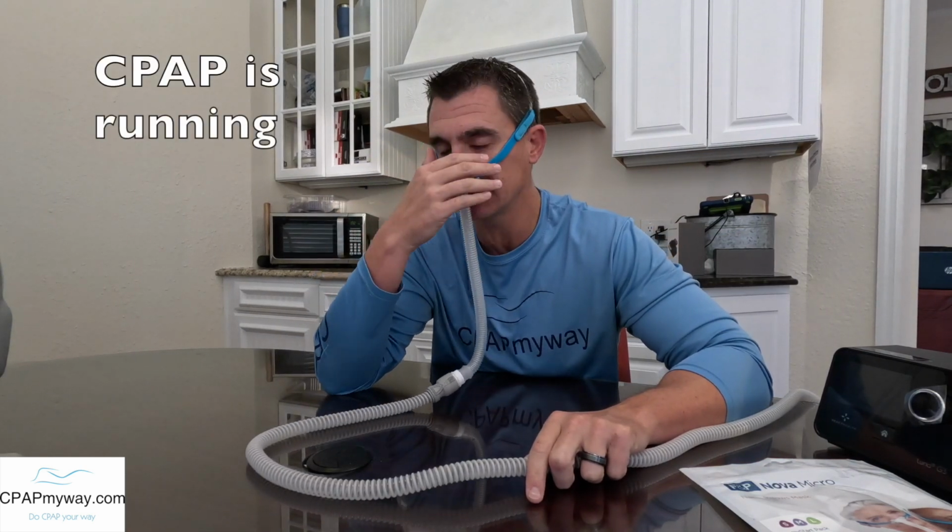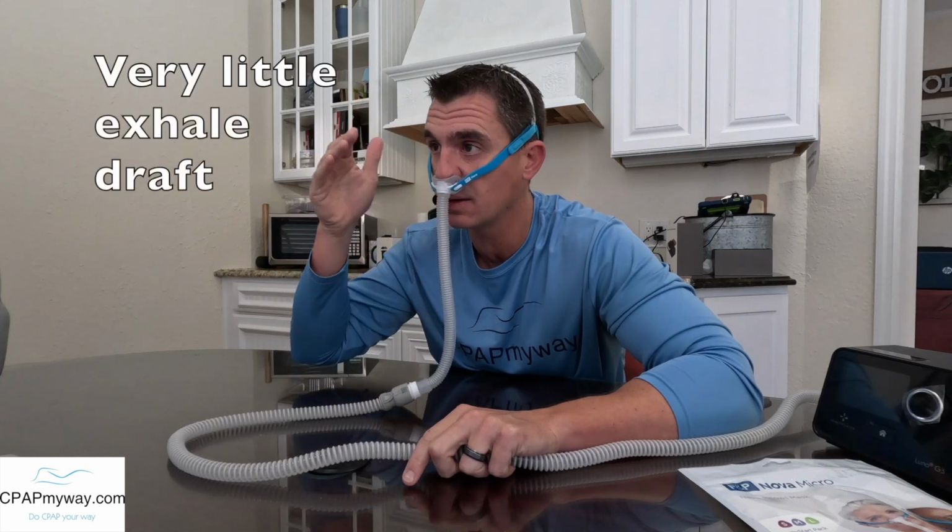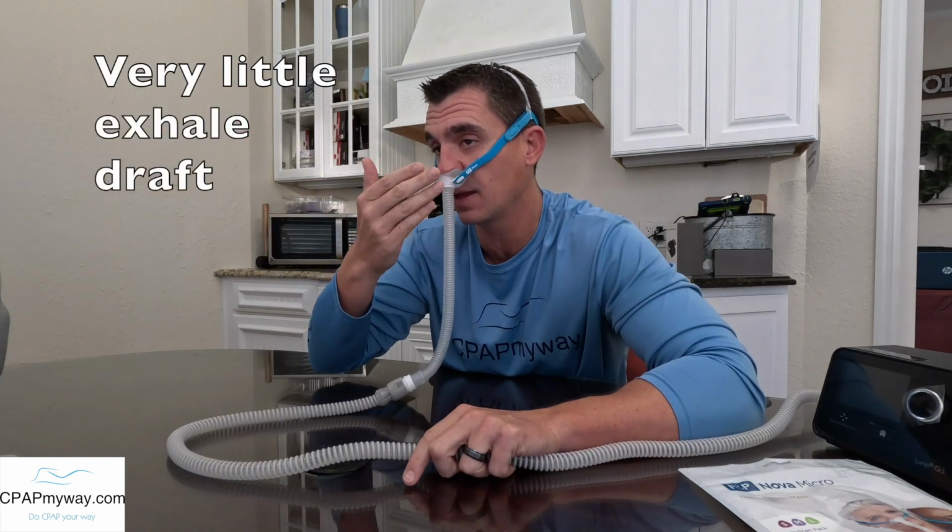Now we'll fire this up. That's where I want to point out to you a little bit about the exhalation. So as far as what's going on in front of my face right now, I don't feel any exhalation until I get right about there, right? So no draft until right about there. And the draft is kind of coming up and out, away from me, but to the sides. And you know how I pointed out the second row of holes? There's a decent bit of exhalation that kind of comes out to the front here, but it seems like most of it is diffused out and away at an angle, which I felt like was pretty unique. I feel it right about there. Hopefully you can see what angle that is coming out, right? And very little in front.